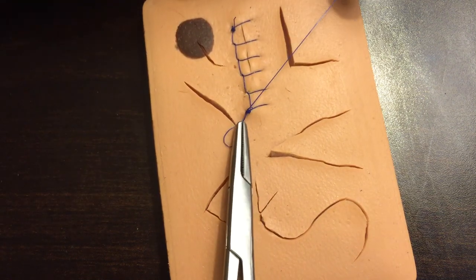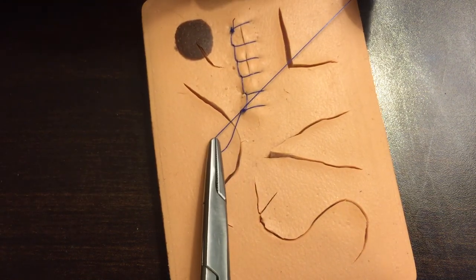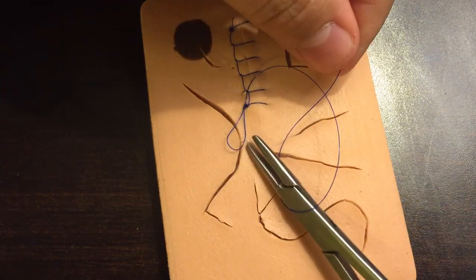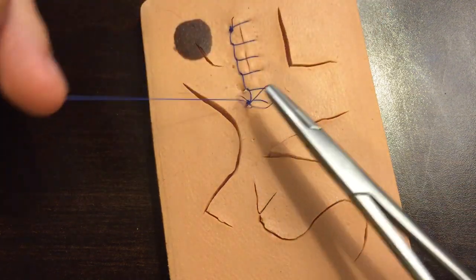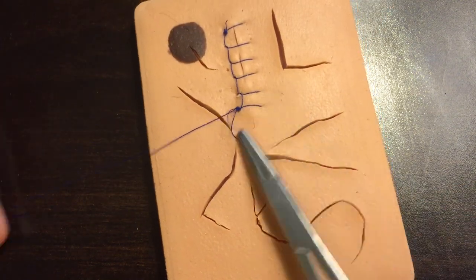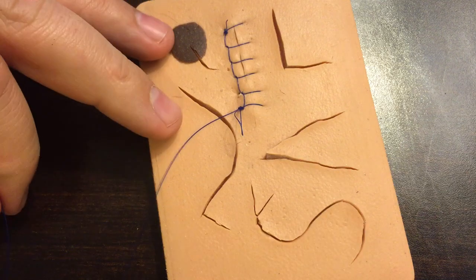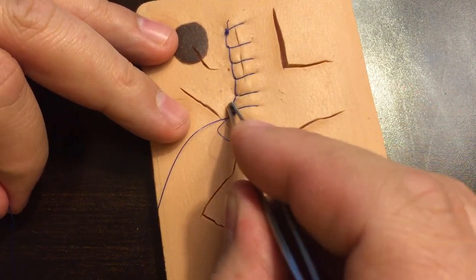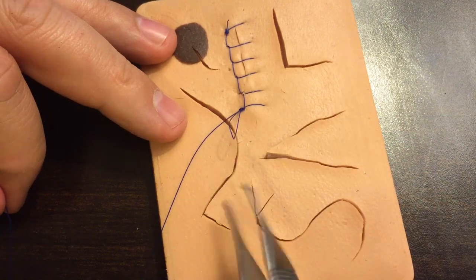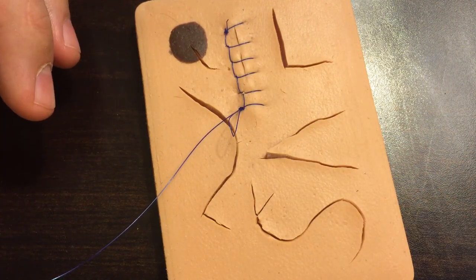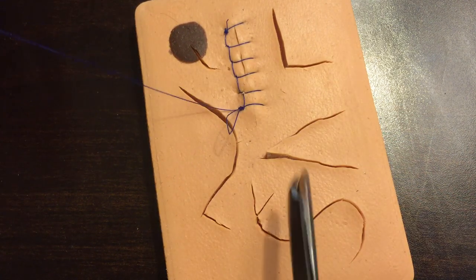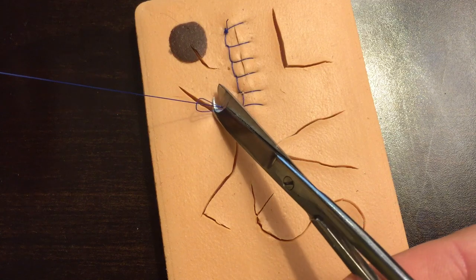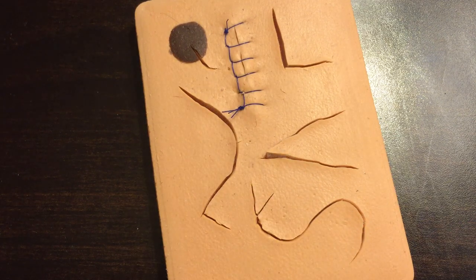See how this is working and you kind of have to sometimes work with pulling both. And then we'll do one more to finish it off for good measure. And there we go. So you might need to rework it a little bit again, just to make sure that everything looks symmetric and everything is flowing well. And then we're going to take our suture scissor and we're going to cut our tails here. And so you end up with three tails on that last bit.